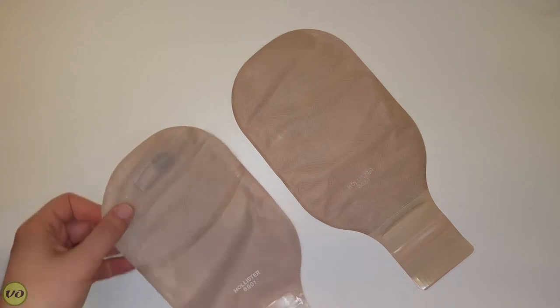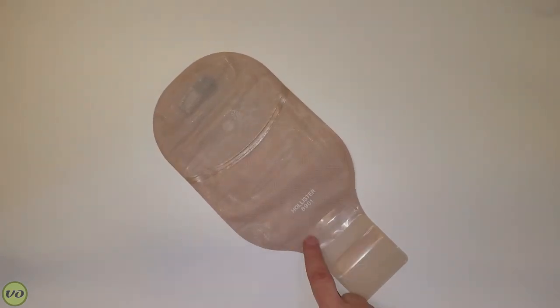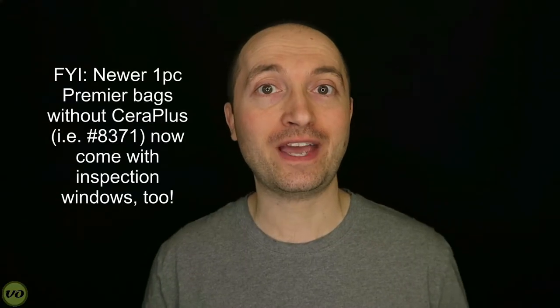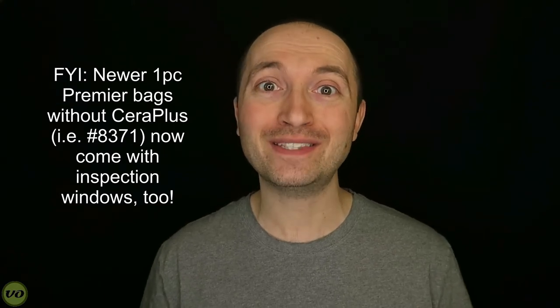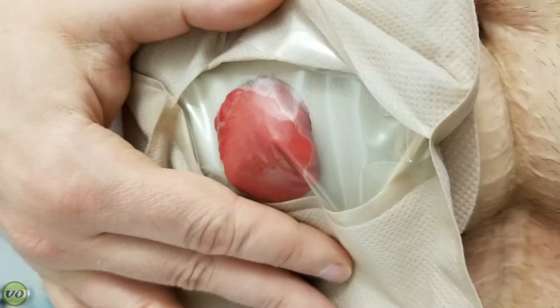One distinct difference that you'll notice — and you can't actually see what it is until you do something special — is that this one now comes with an inspection window. Inspection windows, if you've seen some of my other reviews, I really love them, especially on one-piece systems. When you're putting on a one-piece that has an opaque covering it's very difficult to align it and make sure it's fitting okay. I also personally like to see what's inside my pouch — I like to see my stoma, see what's happening with my output, whether there's gas or actual output.